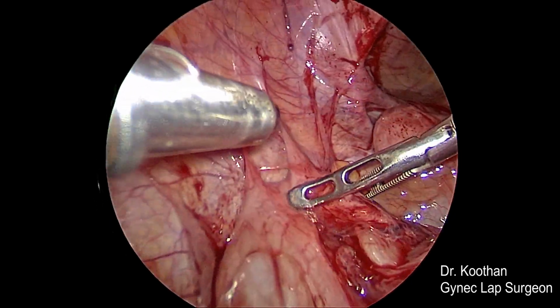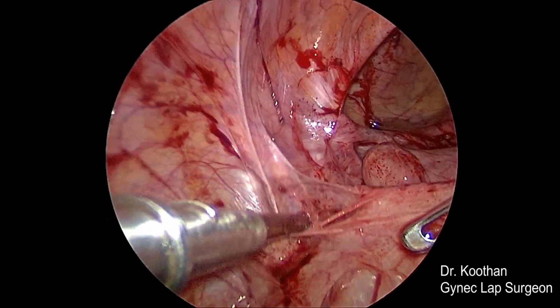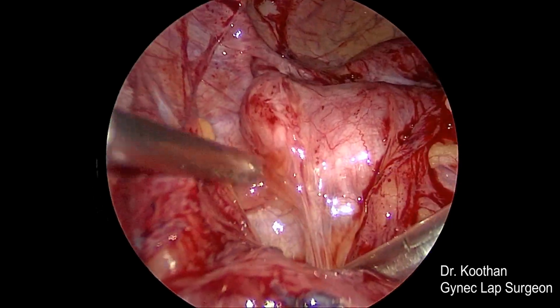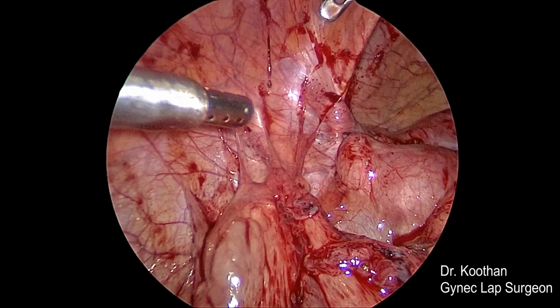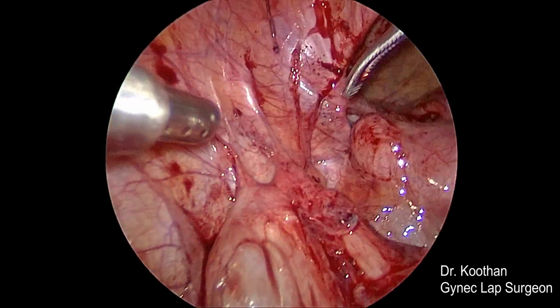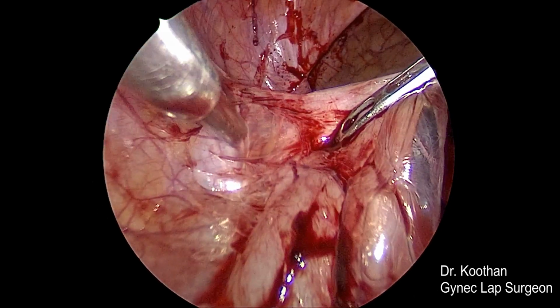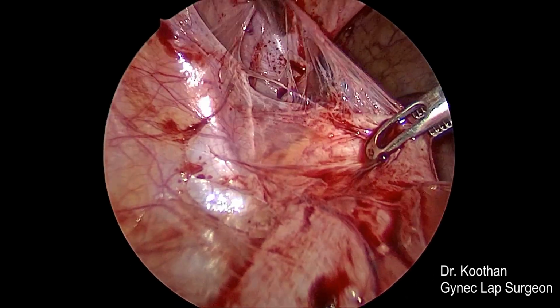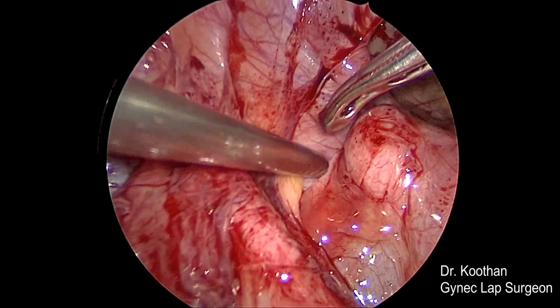This is actually the sigmoid, which is adherent over the left lateral abdominal wall, which is getting released. We have to adequately dissect the sigmoid and push it down so that the lateral wall dissection will become very easy.